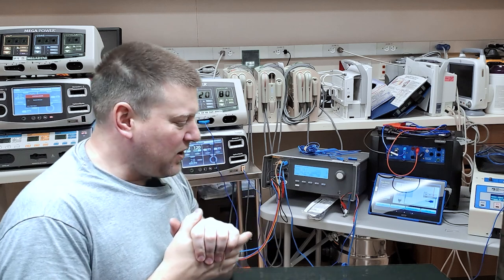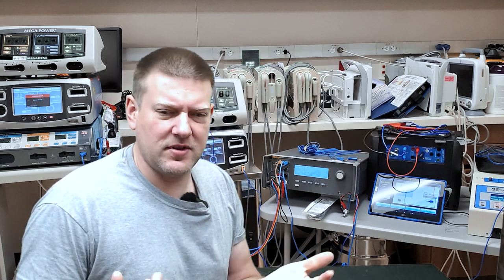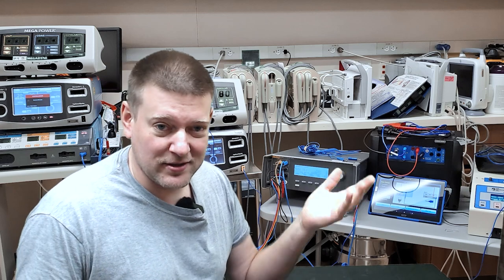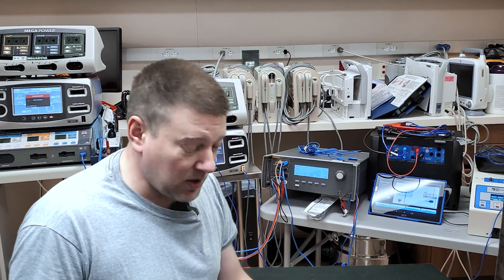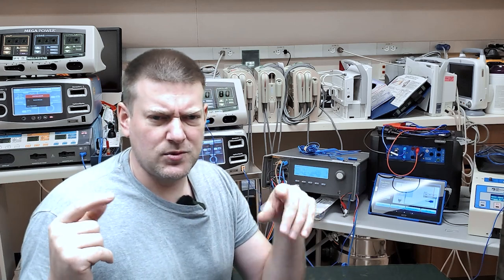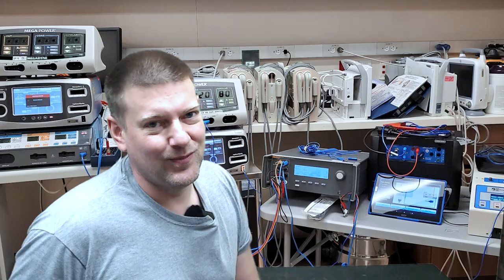Welcome back to Better Biomed. Today we're going to look at a hand control for a surgical table — specifically a radiological table, which means the deck is radiolucent. It's a very special C-arm table. This control is interesting because apparently a doctor took it apart. They've been getting symptoms where the controls are reversed, which is weird — usually you lose one direction due to micro switches or Hall effect sensors. We're going to take a look.